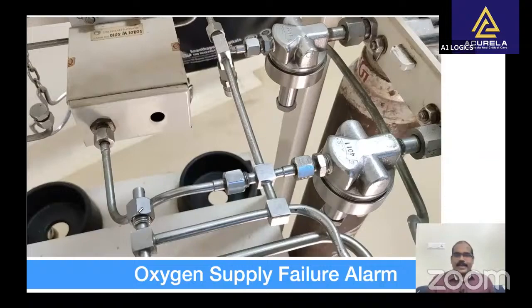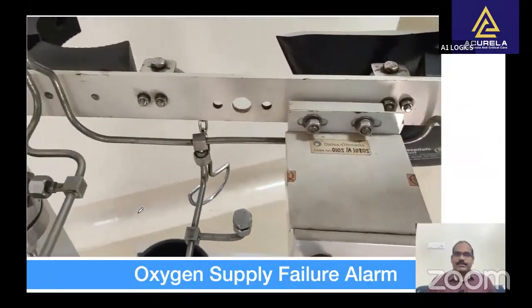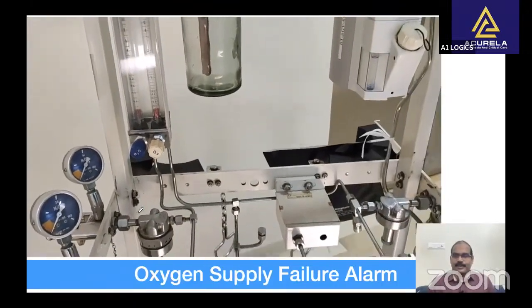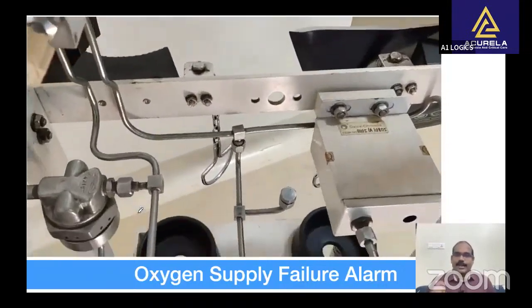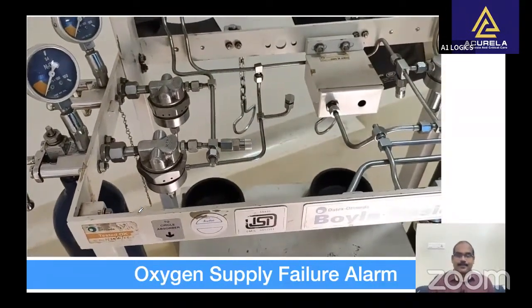Oxygen supply failure alarm. When the oxygen supply pressure falls below a manufacturer specified threshold, usually 30 psig or 205 kilopascals, at least a medium priority alarm should be enunciated within 5 seconds. It shall not be possible to disable this alarm.